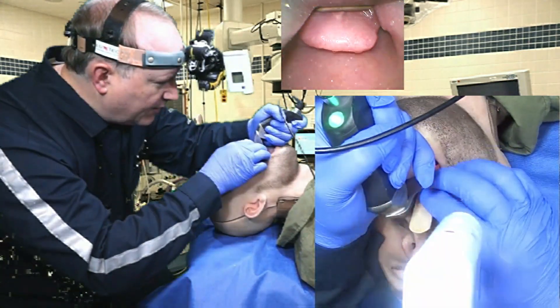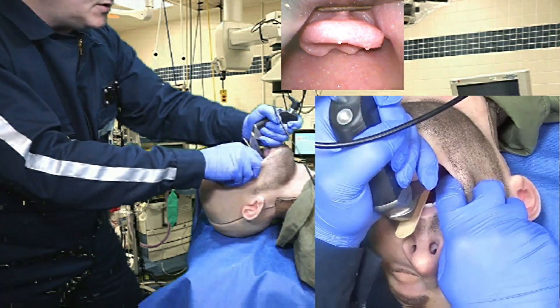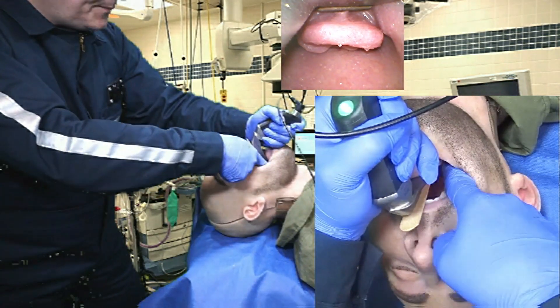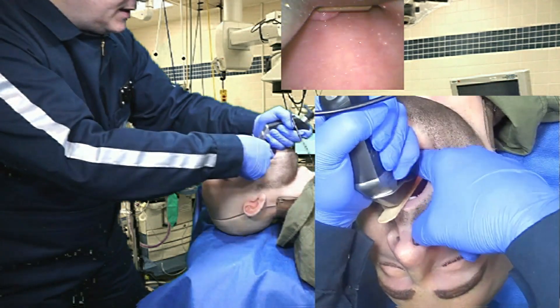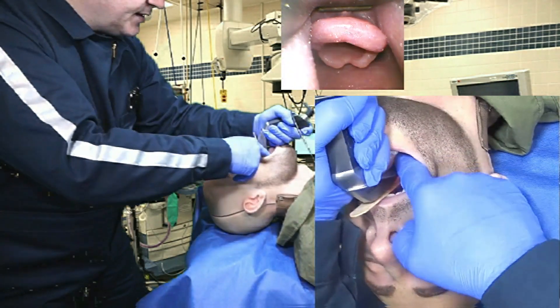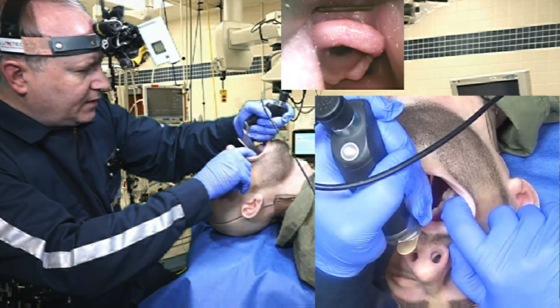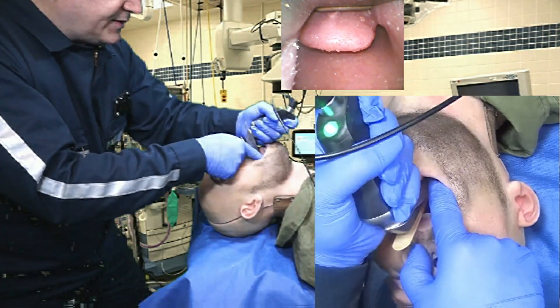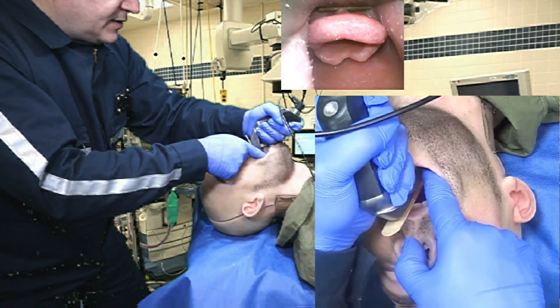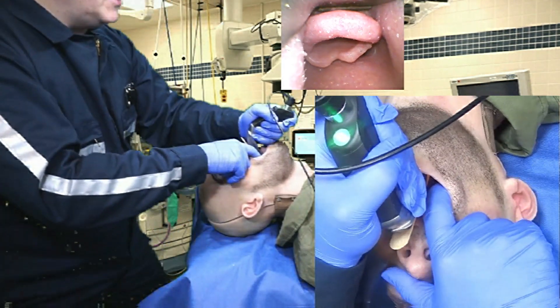I actually have a grade 3 view on direct laryngoscopy. I also have tongue hanging over my tube delivery channel, so I'm going to use my index finger to push the tongue to the left of the video laryngoscope. Now I have a grade 1 view on direct laryngoscopy after using my finger to push the tongue to the left of the video laryngoscope blade. Very interesting.